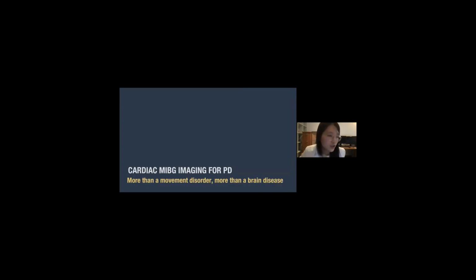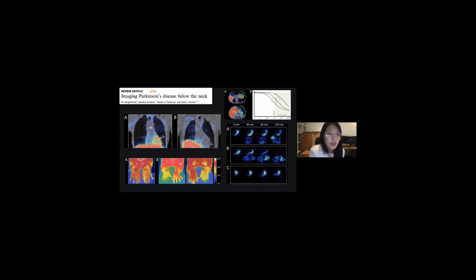Okay, the last issue of this lecture, I will talk about cardiac MIBG imaging for PD. As you know, Parkinson's disease is a systemic disorder. It's not just a brain disease, with widespread alpha-synuclein pathology in the peripheral and enteric nervous system. Extensive pathology is seen in the parasympathetic and sympathetic nervous system and throughout the gastrointestinal tract.